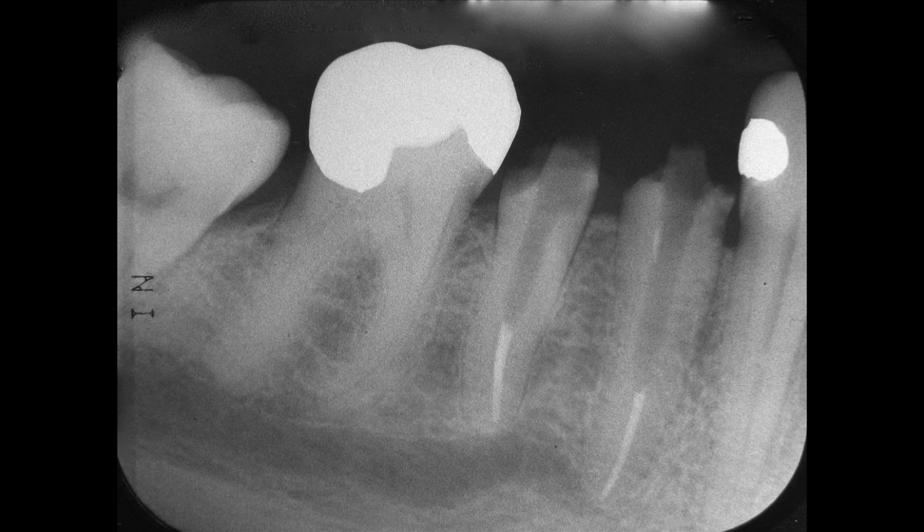Always start with the smallest Gates Glidden or Peeso reamer and work up to the size you want for your post. Size your instruments by placing them against the radiograph and pick the smallest size that removes all the gutta percha at the apex of the root.